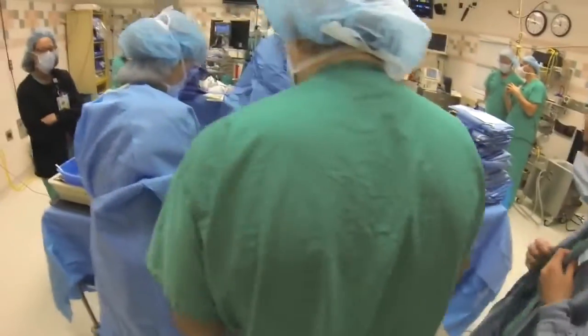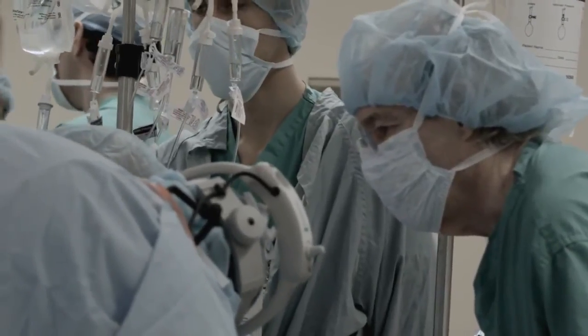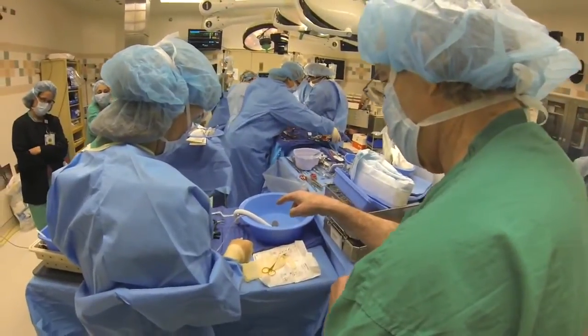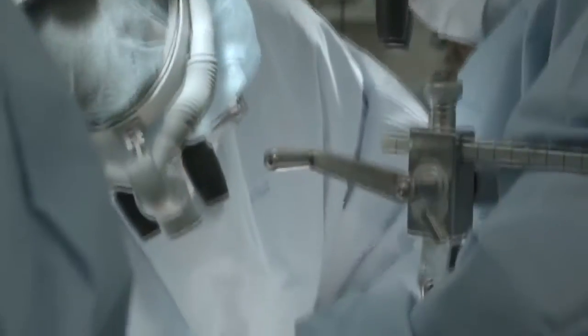We're very cautiously watching him to see long-term how this type of electrical connection will work for many years to come. Dr. Jarovic has really been instrumental in designing artificial hearts and is involved in helping us. Because it's totally implantable, the patients can swim and shower, as there's no external cord.